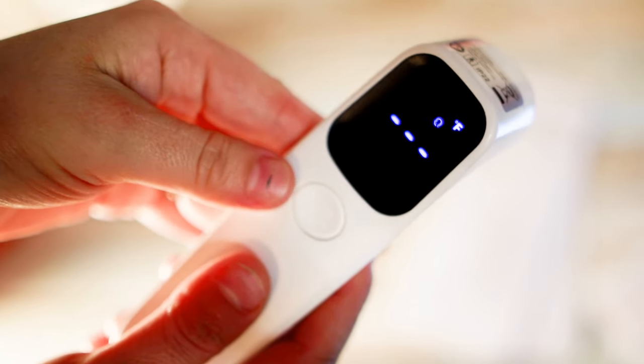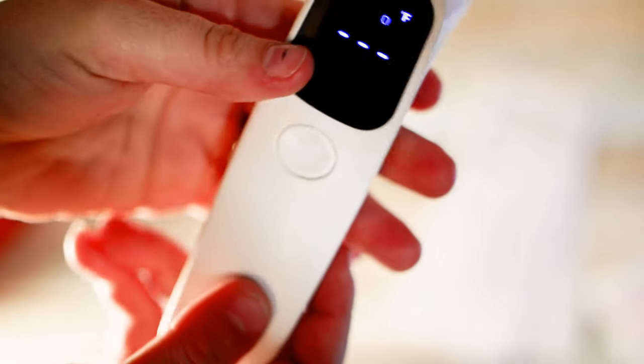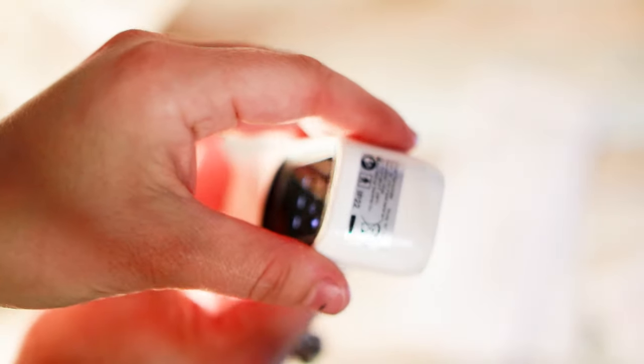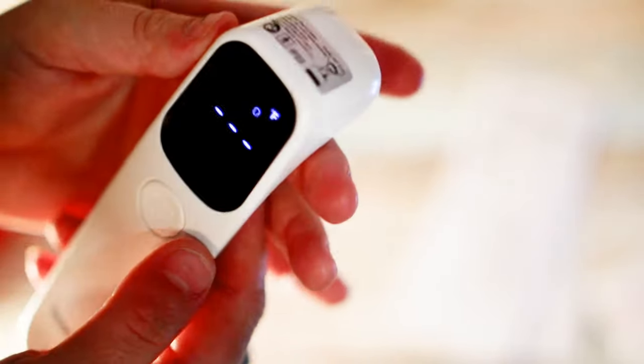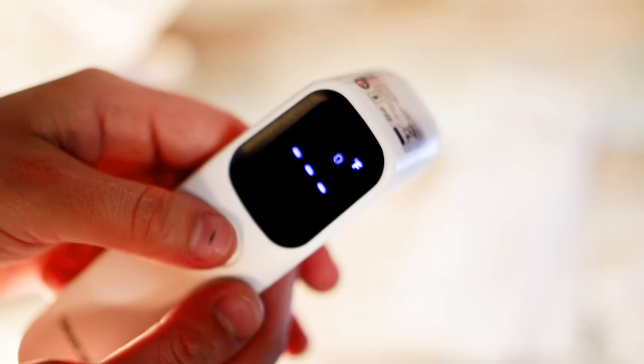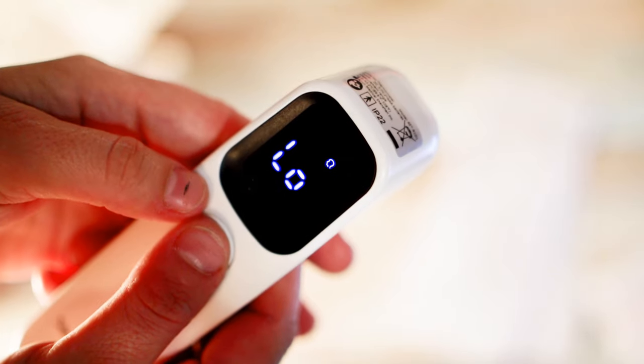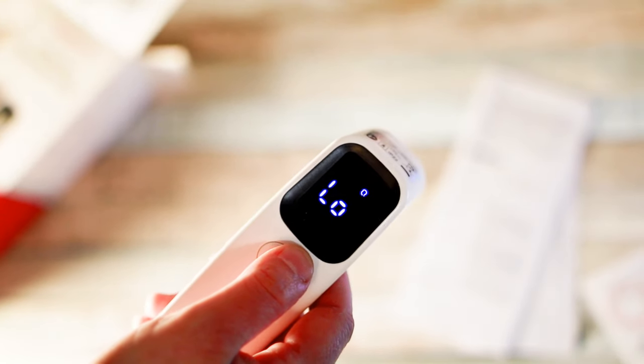That piece snapped in place. So let's get a little bit closer — and there we go, here's our thermometer. Still lightweight even with the batteries in. It's going to say low. So let me just try on my arm — I'm going to check my arm to see if it'll give us anything.